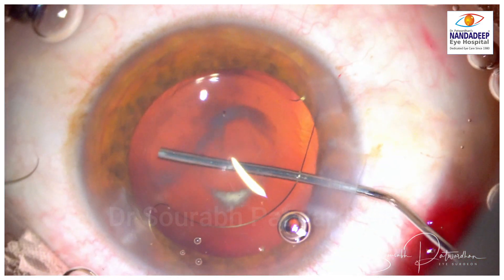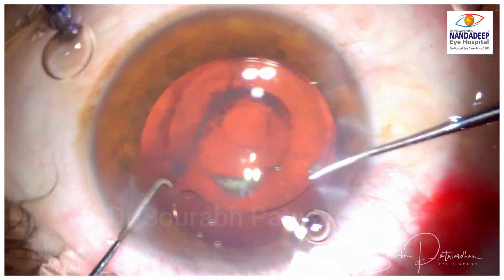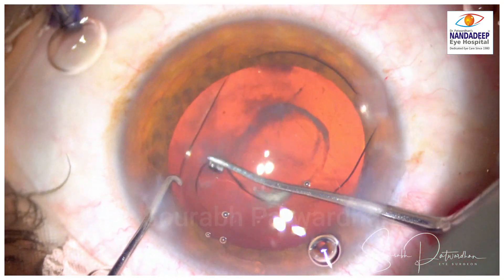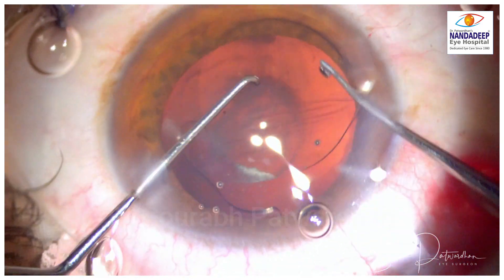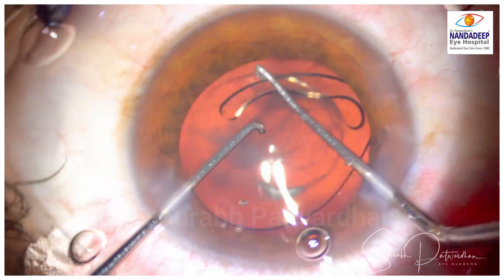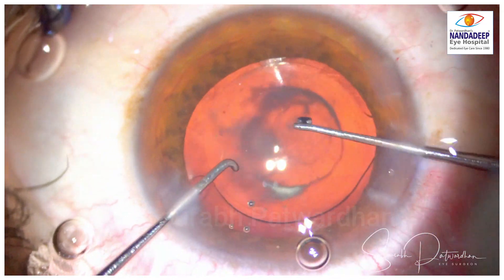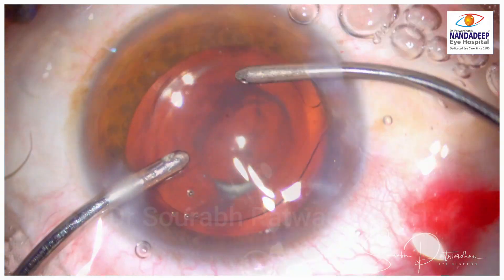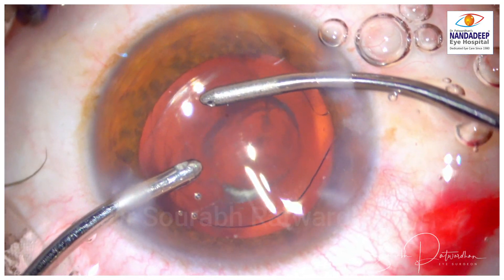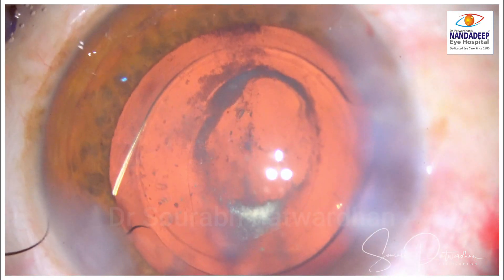Now I am going to place the PCL in the bag. First I place it in the anterior chamber and then push the haptics right into the bag, avoiding excess pressure on the posterior capsule. Now the visco is being removed — this is the end of the surgery.